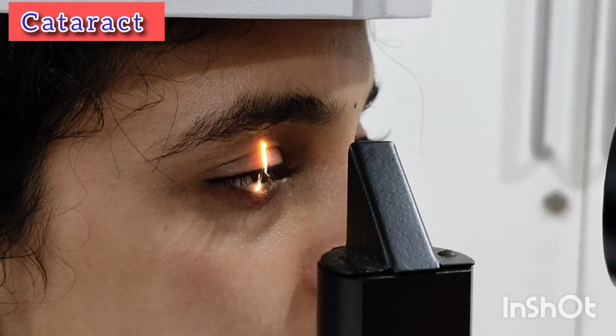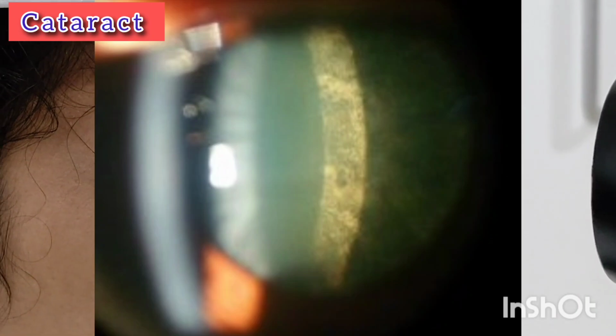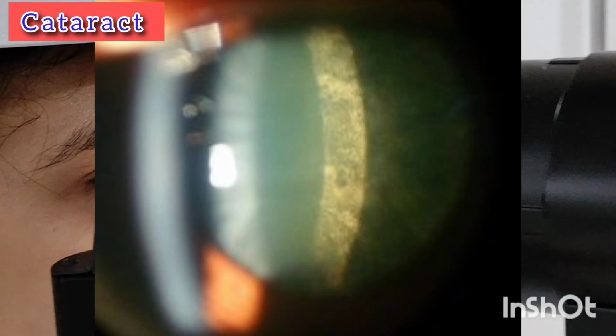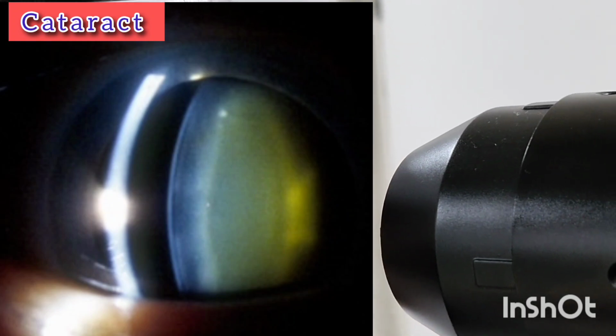Finally, we should examine the lens. Examine the anterior lens first, then focus on posterior lens. The beam should be slightly wider for posterior capsule and then make it thin to examine the nucleus.